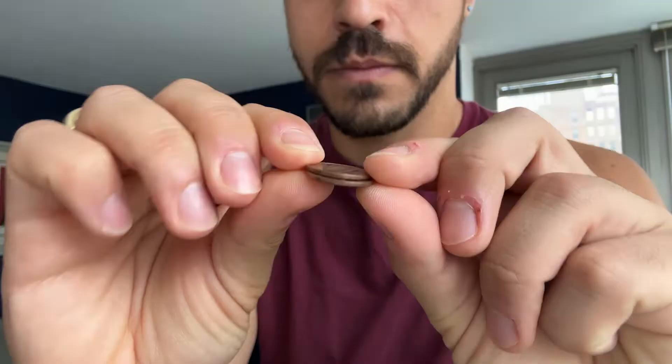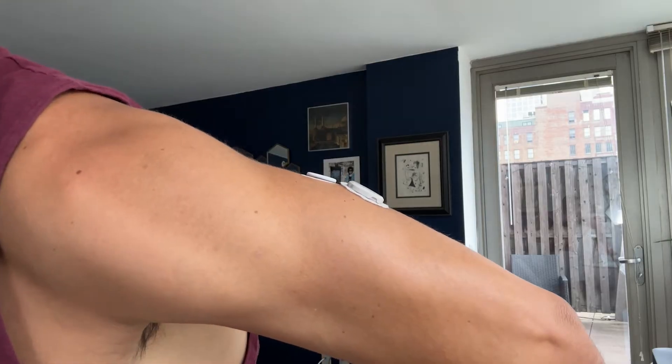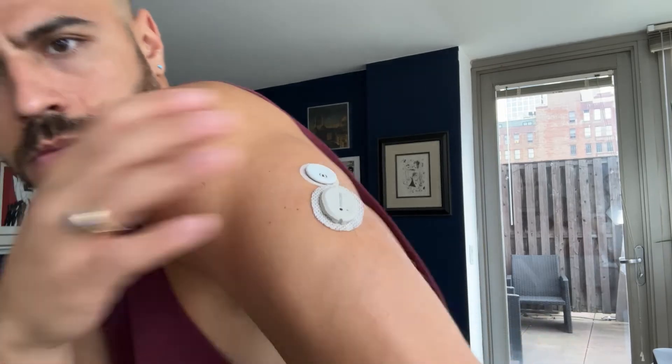Can we talk about how small this thing is? It is the size of two stacked pennies. This is what it looks like next to the Dexcom G7. The Dexcom G7 is 60% smaller than the G6, which many of you may be wearing. So just imagine how much smaller this one is than the G6.